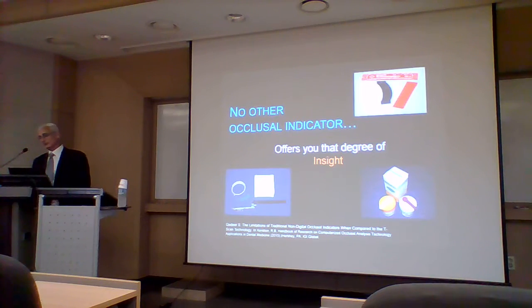The most common one we use is articulating paper. And articulating paper, we are taught that it measures force by its size. But studies in the literature show that's clearly not the case. It doesn't have that capability. It's just ink that smears on the teeth.